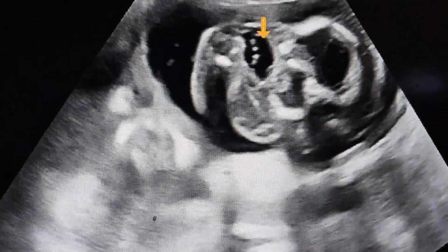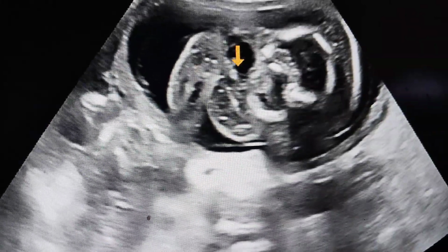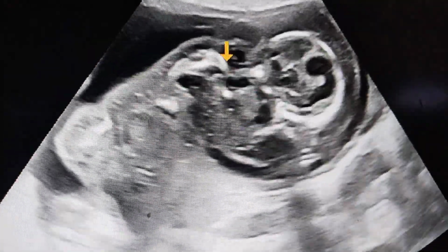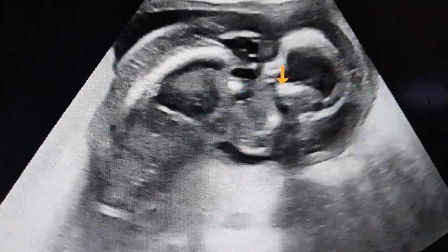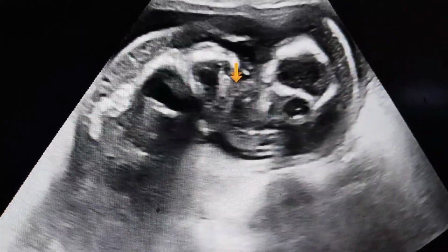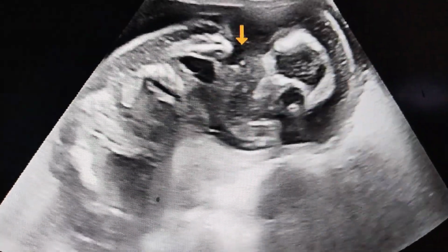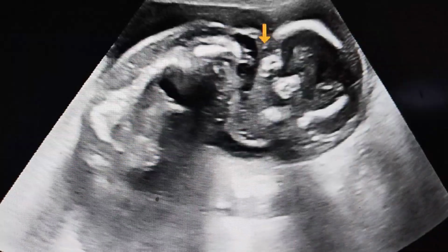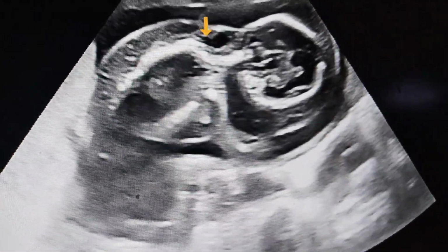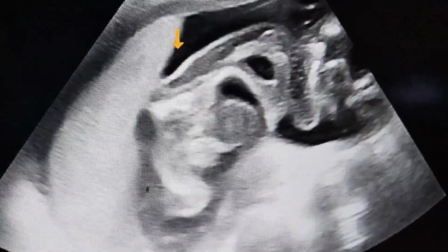This one you can see. This is the neck, and this cystic area is present at the neck of the fetus on its lateral side, posterolateral side. So here in this fetus, the obvious cause of hydrops fetalis is this cystic hygroma. Due to this lymphatic obstruction, fluid leaks out under the transudation action and then accumulates in the fetus's subcutaneous tissues.